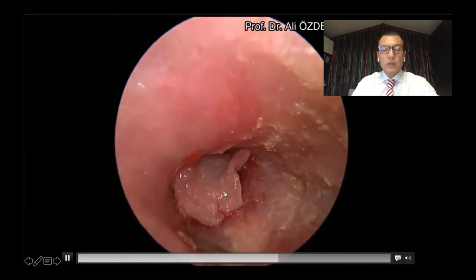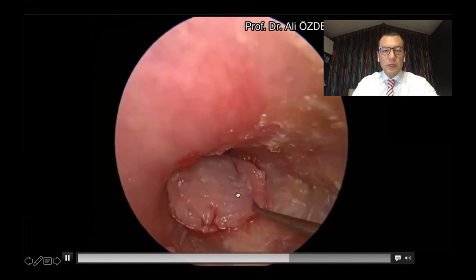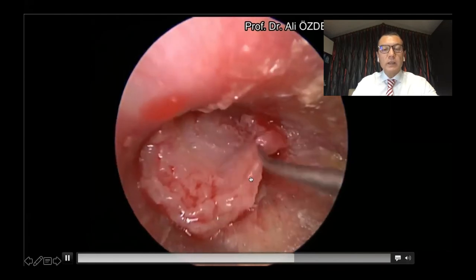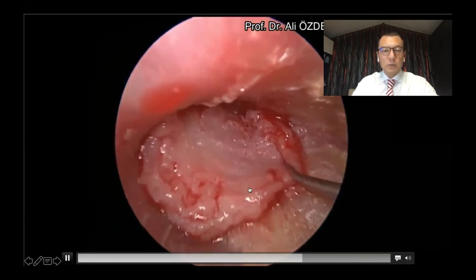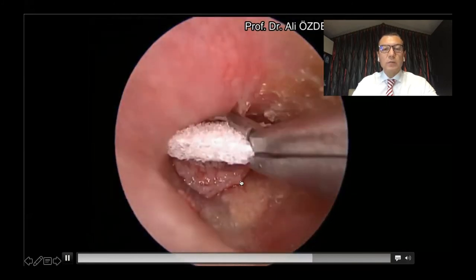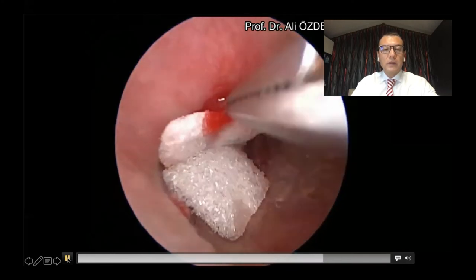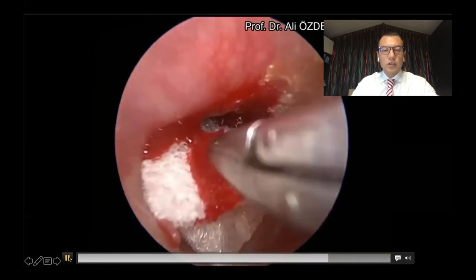Then we insert the inner part of the cartilage inside the perforation, and the second part covers the outside of the perforation. And then we put some absorbable gel foam and we finish the surgery.